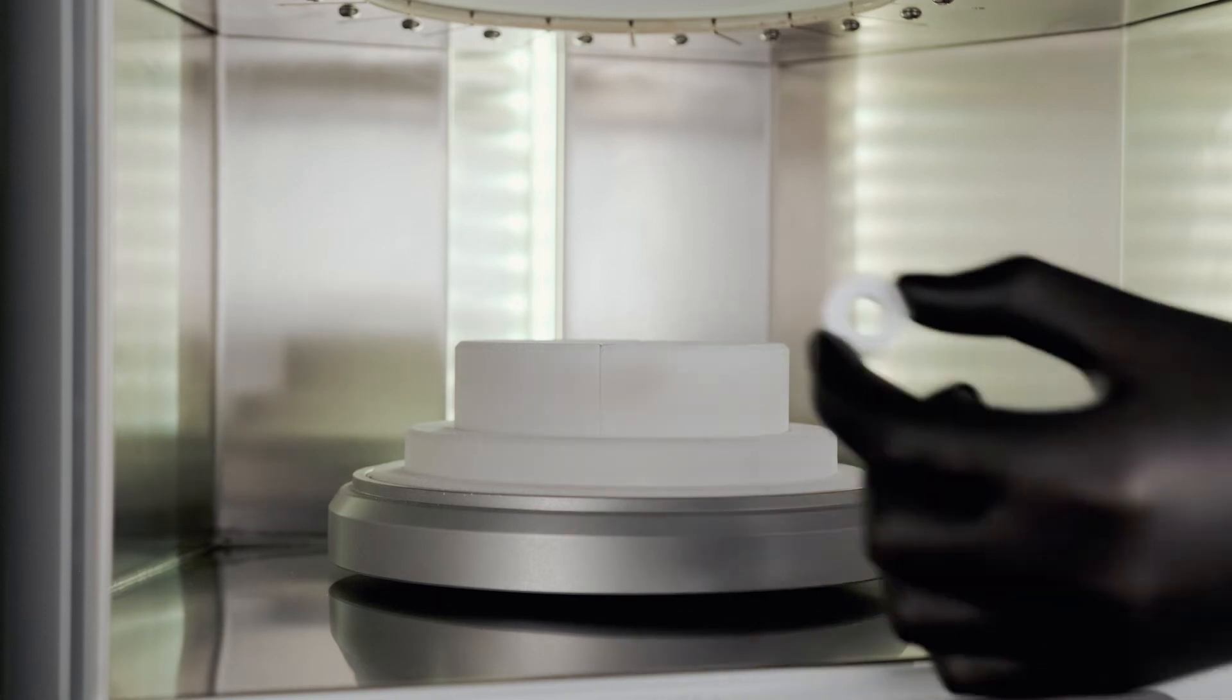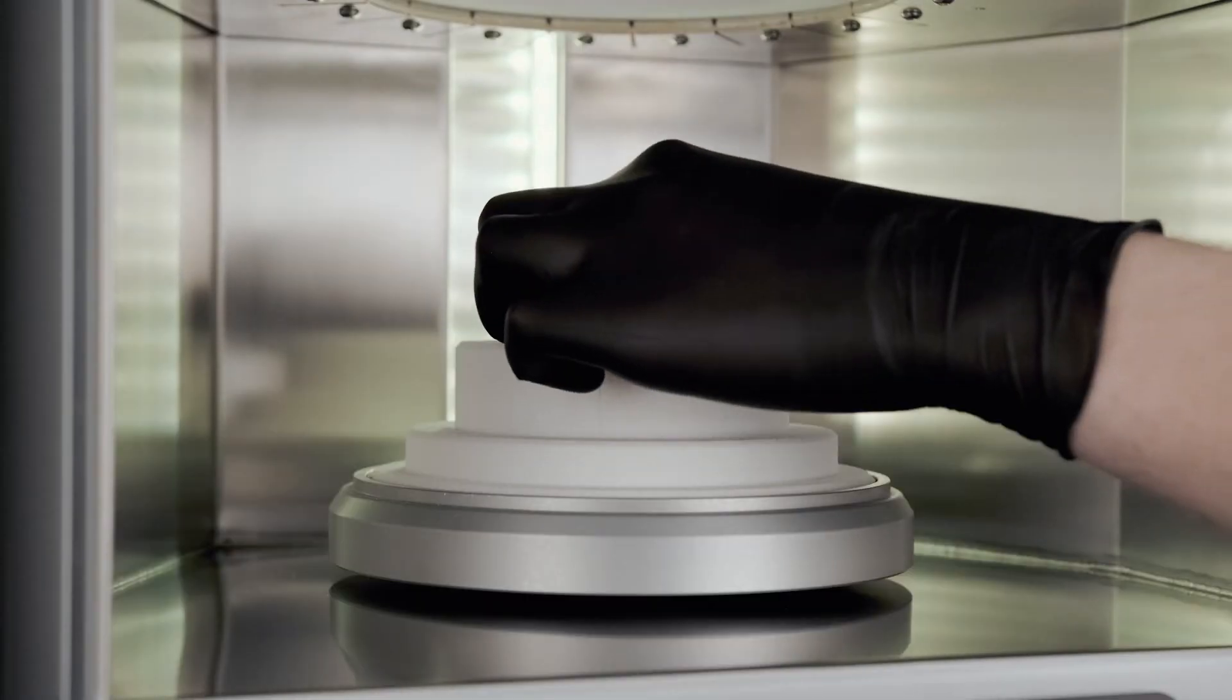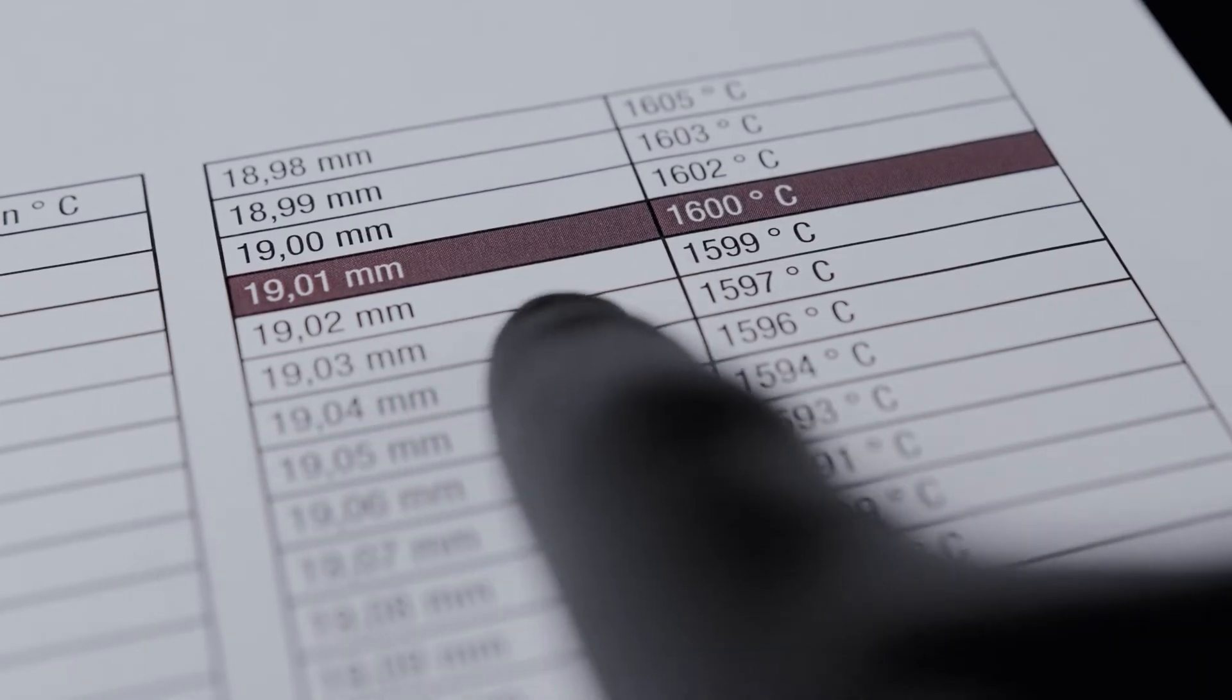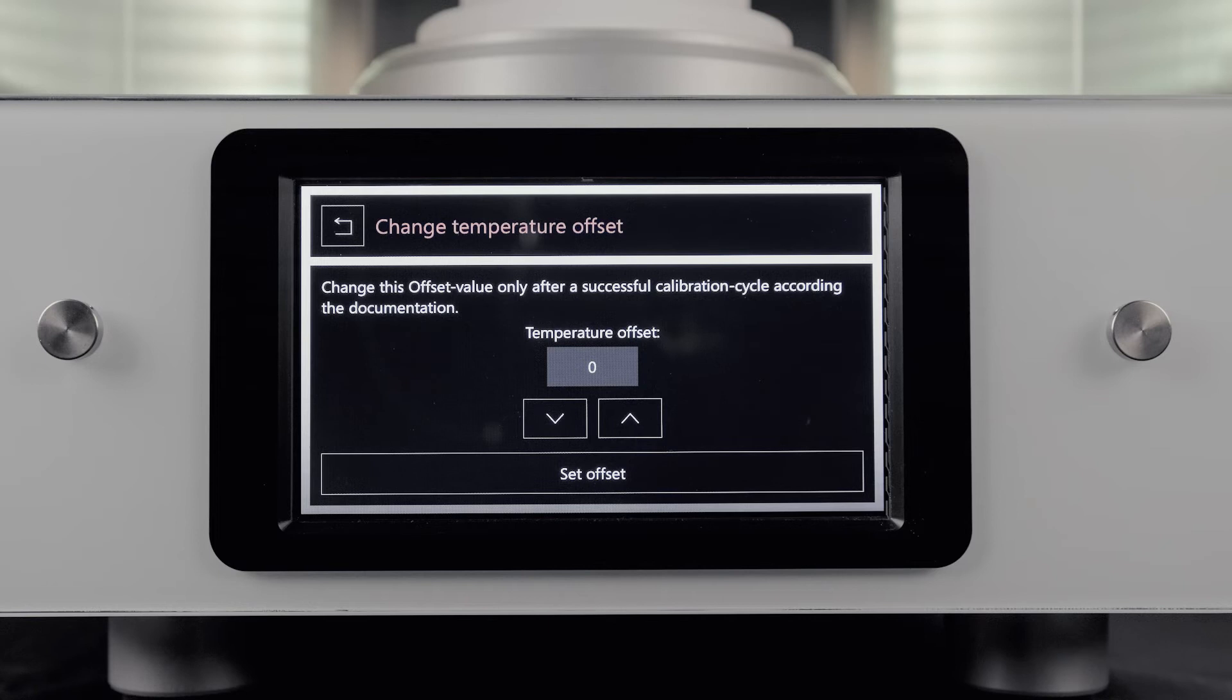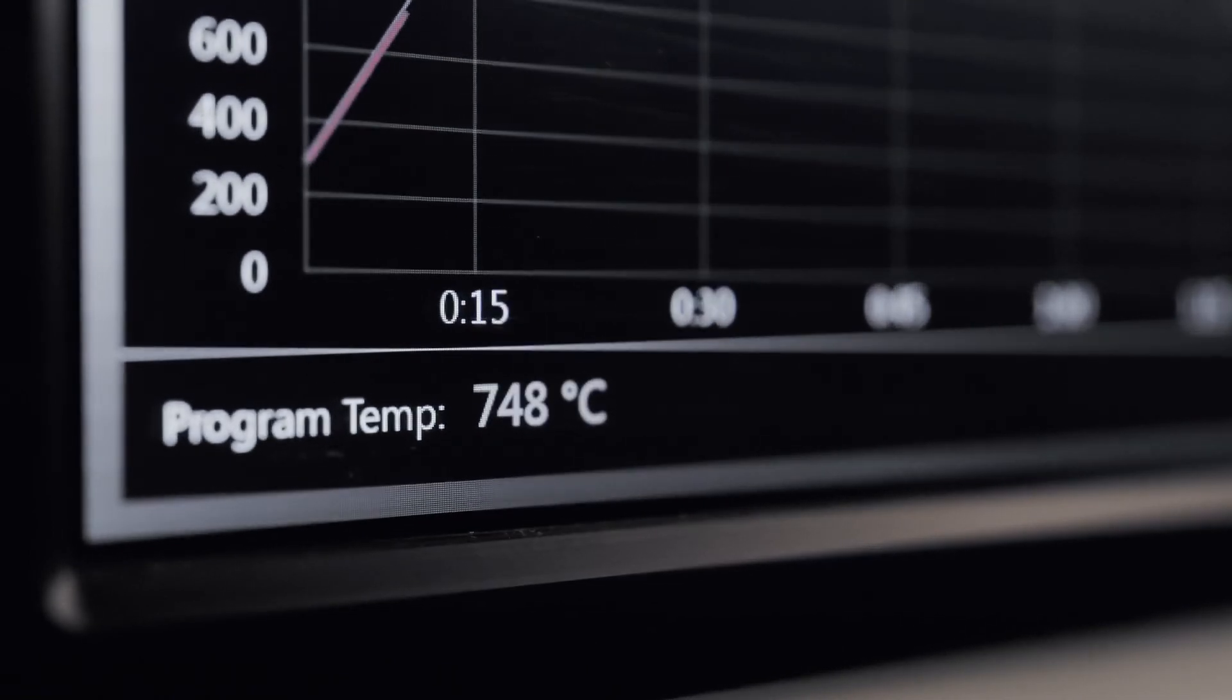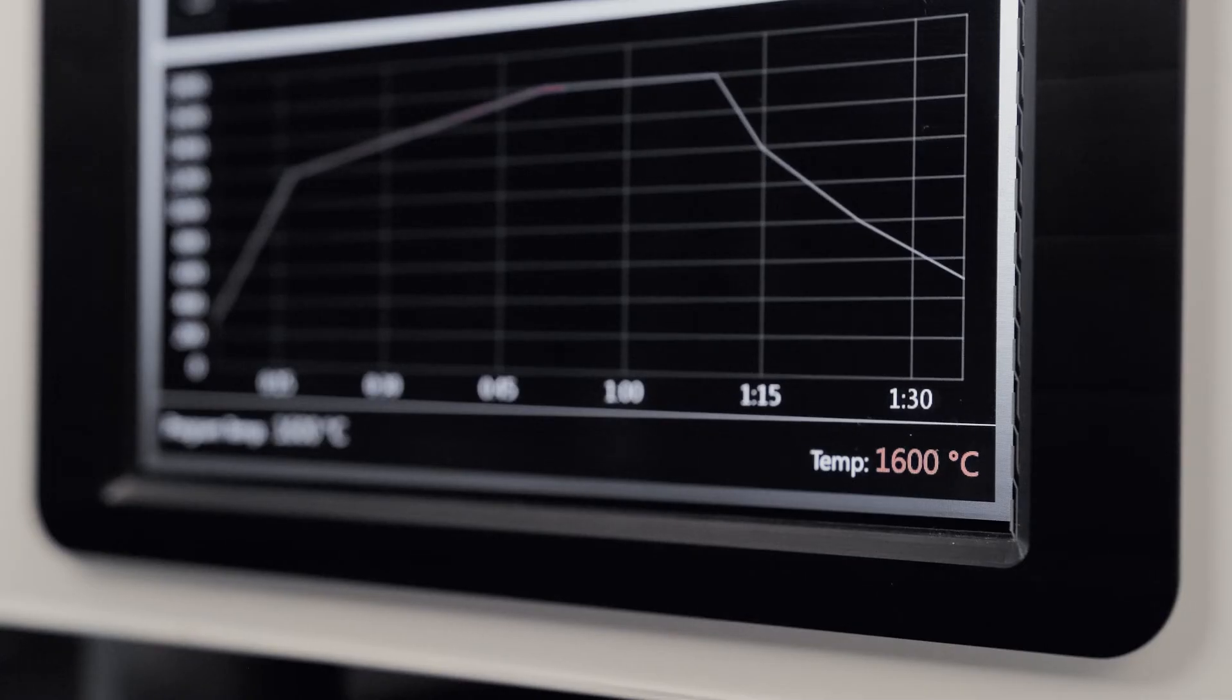In this case, all you have to do is sinter a calibration ring with a specific program and then compare its diameter with a reference table. The difference can be corrected directly in the software so that the furnace is always optimally calibrated and reliably achieves a control accuracy of plus or minus 2 degrees Celsius at a final temperature of 1,600 degrees Celsius.